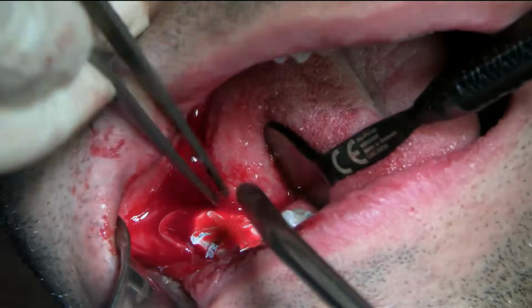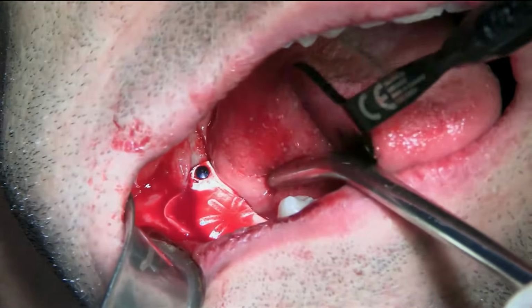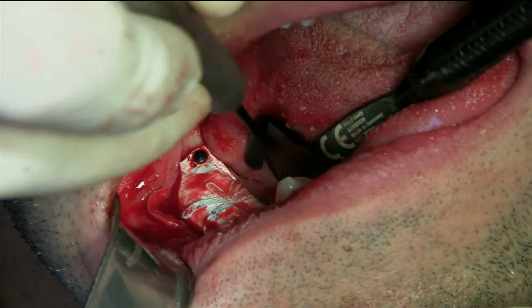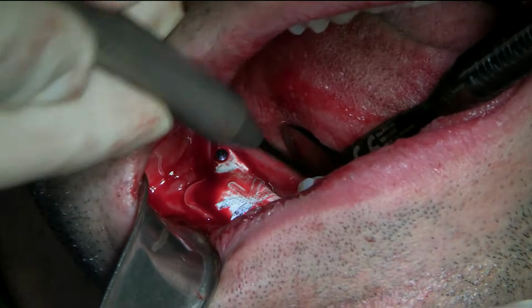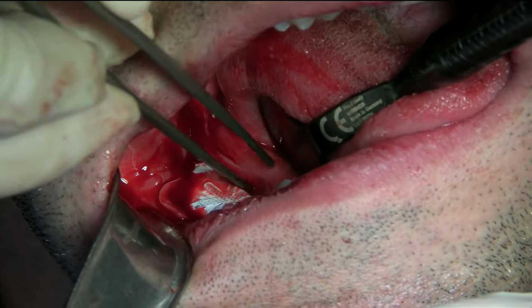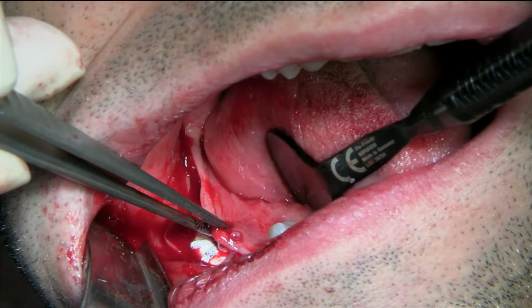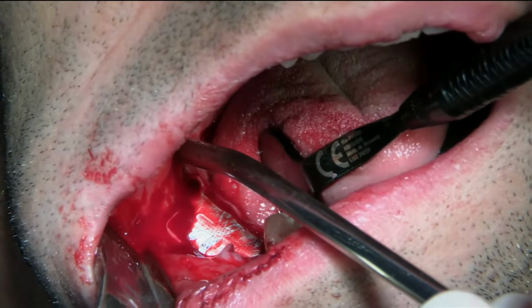Lingual? I need the lingual flap. I know where it is. Need to find the lingual flap. Get over here. Okay. We have some anesthetic. Starting to wake up here. Here's the lingual. It's coming all the way over the ridge. Look. So that'll give me a nice. Okay. Yeah.